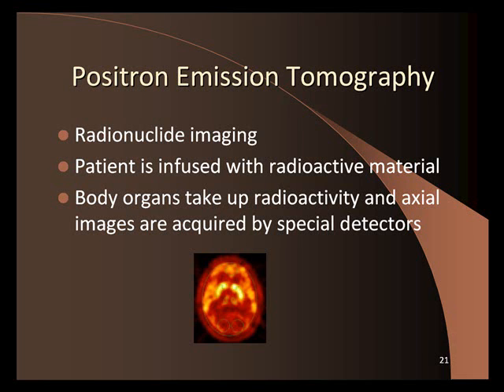For example, the doctor will look at a CT scan and see tumor, just because it got denser. Remember, a CT scan shows you density. But how much of that tumor is active growth? That's what the PET scan is going to tell you. The PET scan will show you some of the tumor, but the parts that are highlighted the most are where there's the most active tumor growth, where there's the most metabolism going on. The doctor needs to know that because they might want to deliver more dose to that part.